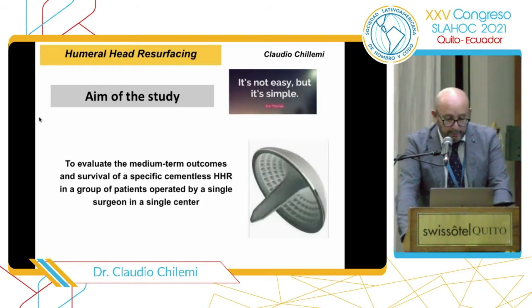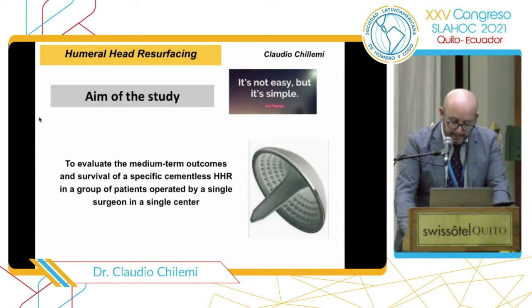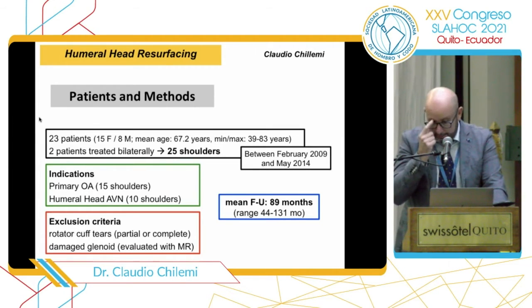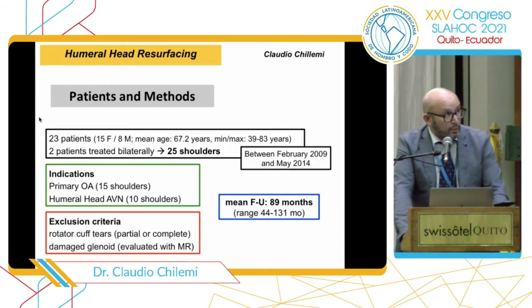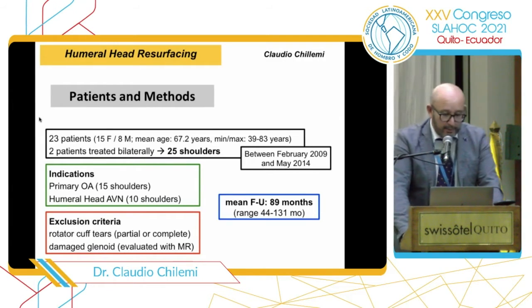So the aim of the study was to evaluate the medium-term outcomes and survival of a specific cementless humeral head resurfacing in a group of patients that I had operated on in the single center where I work. 23 patients were enrolled for the study, and 2 patients were implanted bilaterally. So we enrolled 25 shoulders over 5 years between February 2009 and May 2014. The indication was primary osteoarthritis in 15 shoulders, while in 10 shoulders we had a humeral head avascular necrosis.